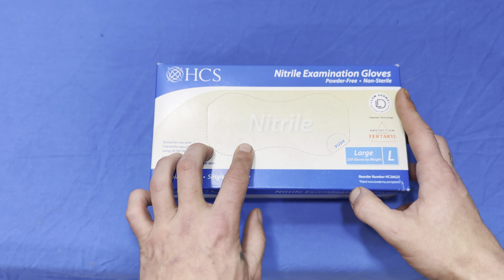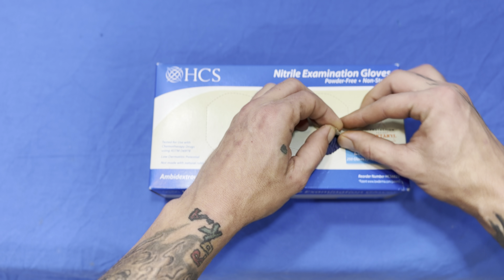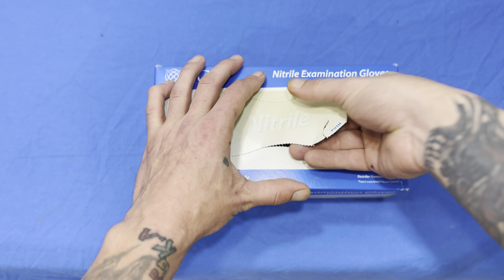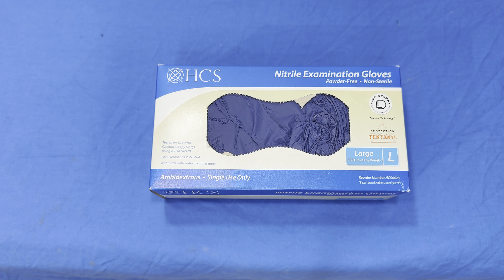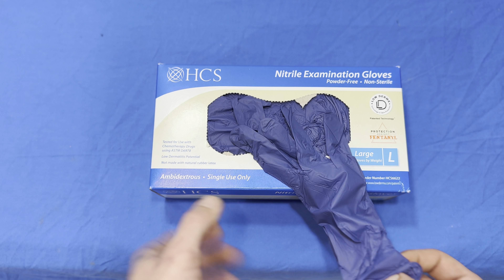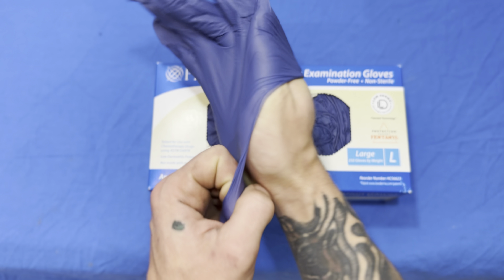We have the HCS nitrile examination gloves. They're the 250 box by weight, not by count, so approximately 250. We already checked out the vinyl gloves, so we thought we would try some nitrile gloves this time. These are ambidextrous, so the gloves will fit on either hand.